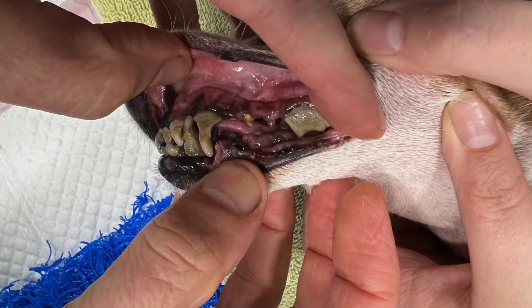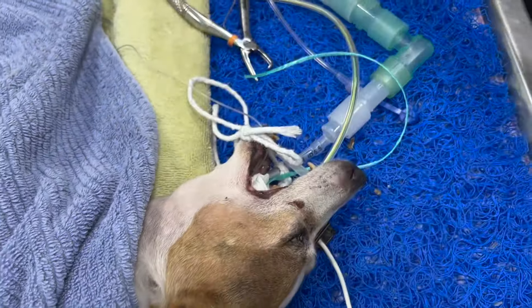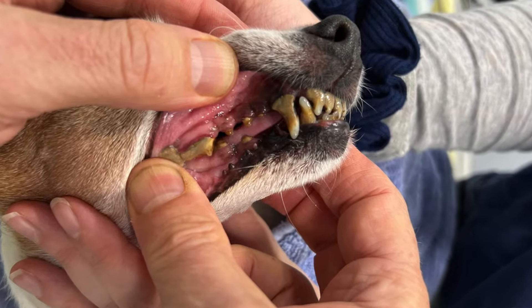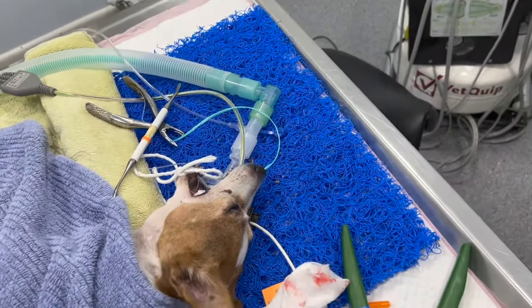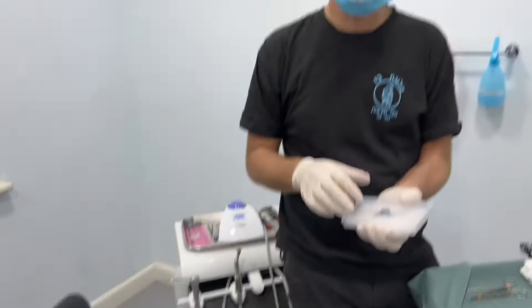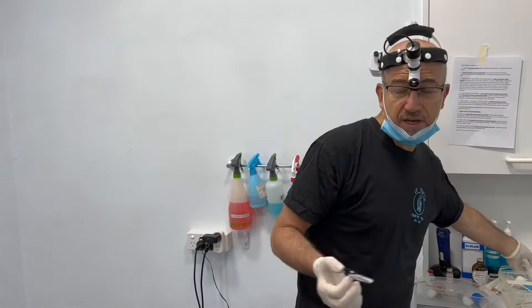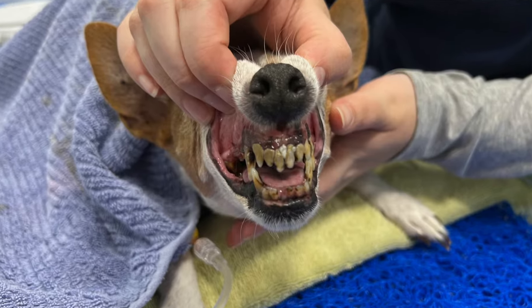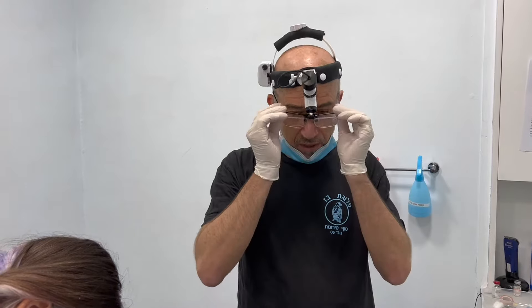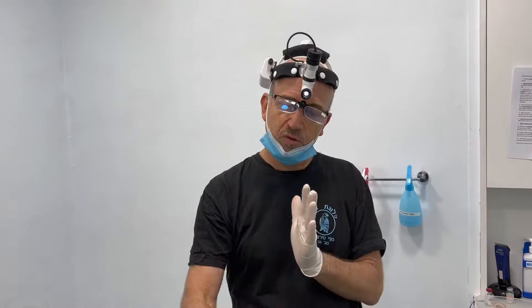We're going to be taking out this really big carnassial tooth. It's the hardest tooth to get out and the biggest tooth. When hyenas are chewing femurs of giraffes in African game reserves, it's that tooth — the big tooth that crushes. It's the strongest tooth in the mouth, the hardest to get out. It's got three really big roots, and that's why we don't just pull teeth — we cut the three roots into three separate pieces and take them out individually.